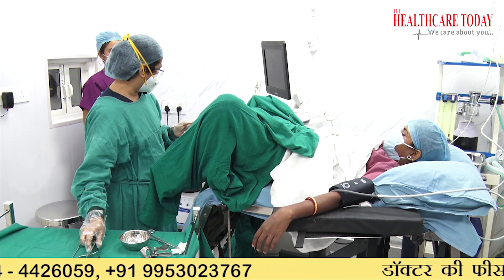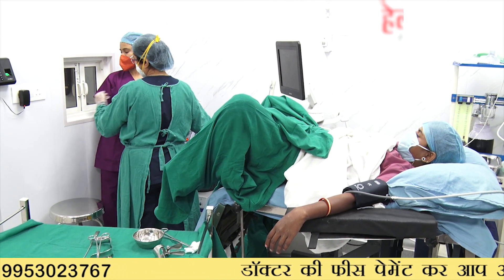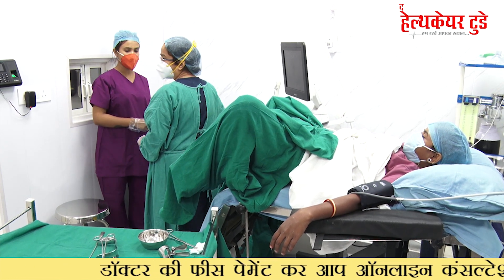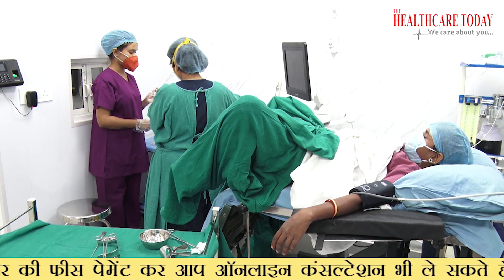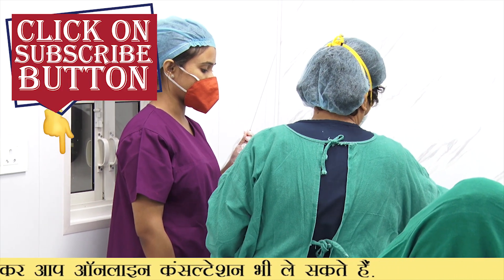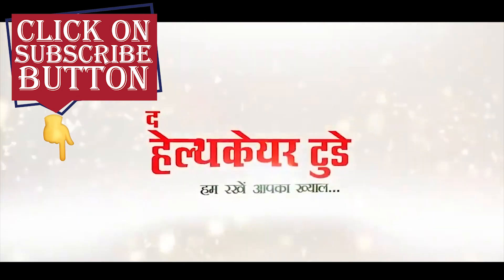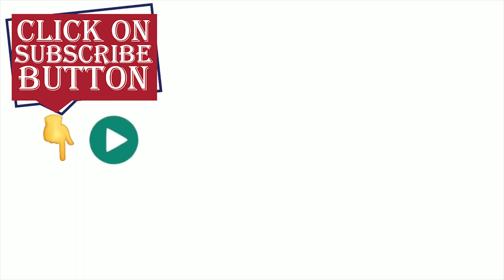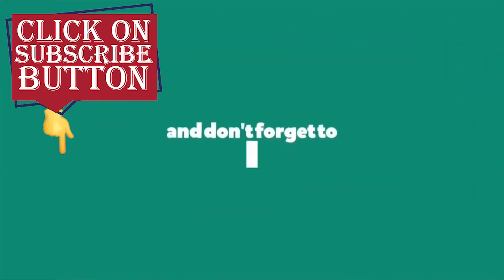The follicular fluid is sent to the embryology lab, whose window is always near the OT so the assistant can give it to the embryologist directly. The embryologist screens it. Temperature is maintained throughout, and typically the samples are passed through a dedicated window to the embryologist.